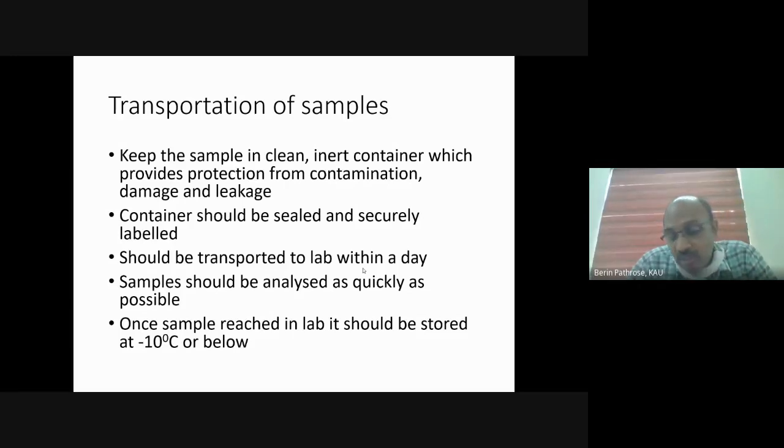And one thing we should ensure is that the sample is properly sealed and labeled. That labeling is extremely critical. The container should be labeled properly, sealed properly, and transported.